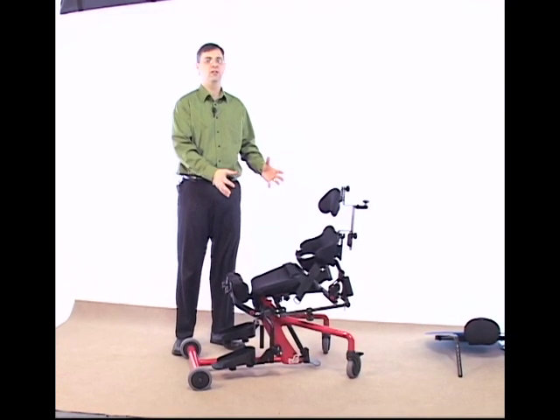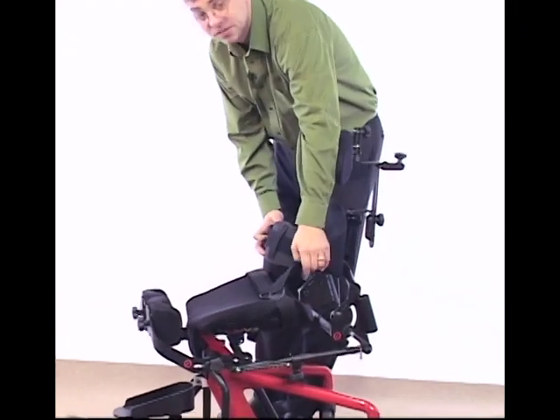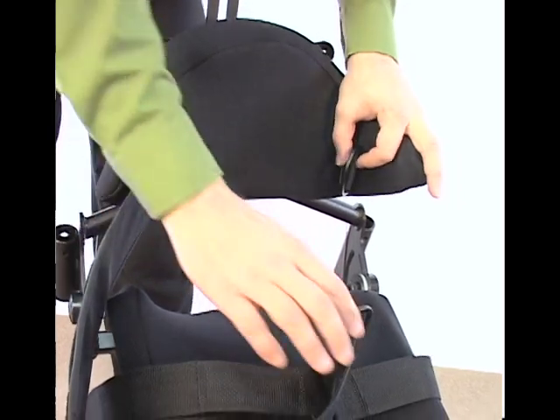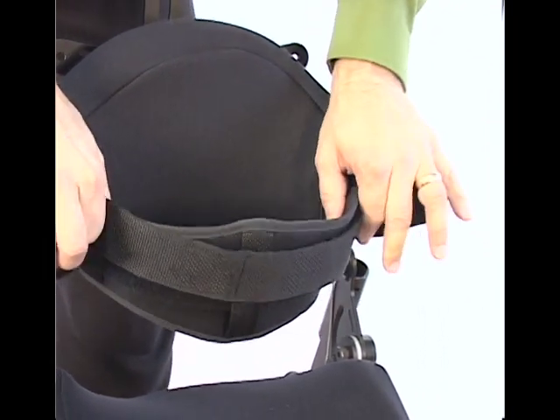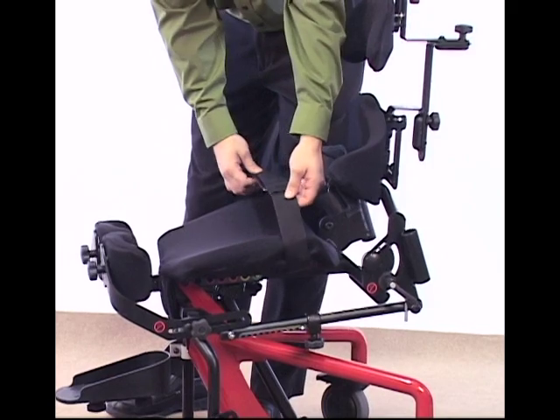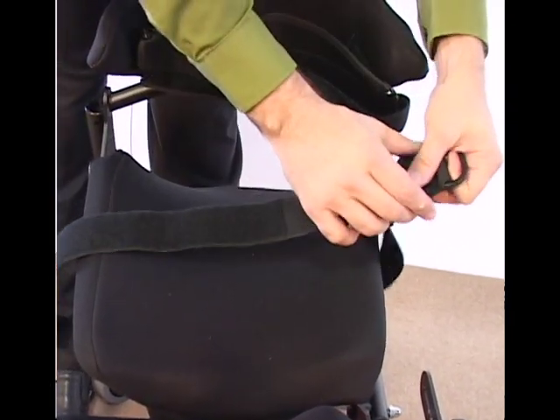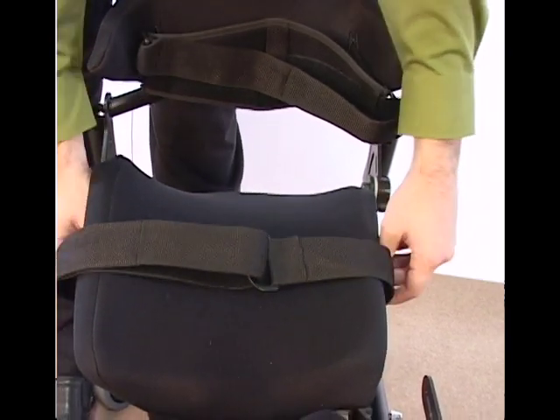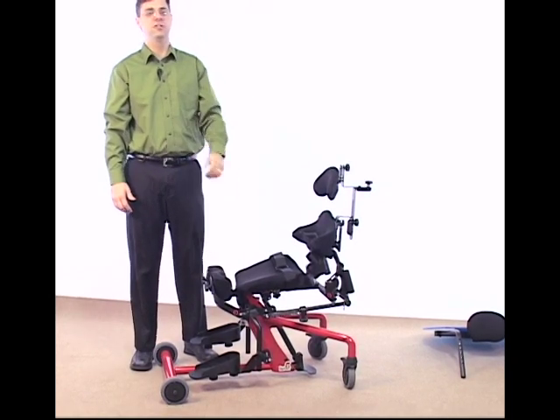So far we've taken a look at seat depth, foot positioning, and knee positioning. Now with the child seated in the Easy Stand Bantam, let's look at strap positioning. The basic Bantam comes with a chest strap — a Velcro system that adjusts through a D-ring. Tighten it securely and wrap it over itself to give the child good thoracic support. As an option, you can also order a seat belt or a positioning Velcro belt, which also adjusts with the D-ring and can adjust along the bottom of the seat as you adjust seat depth. You can also get foot straps for your foot plates, especially helpful when setting the child in plantar position for extended periods of time.